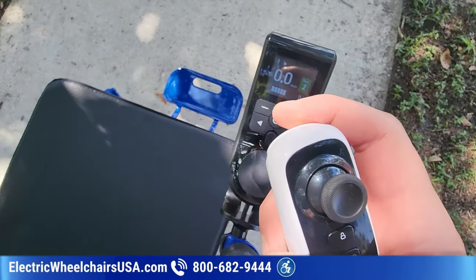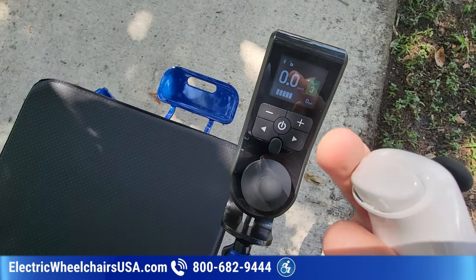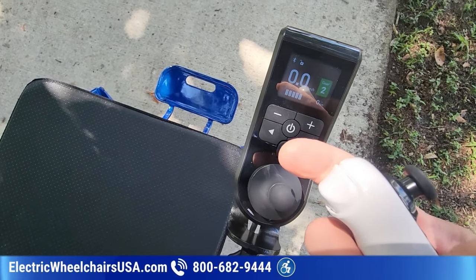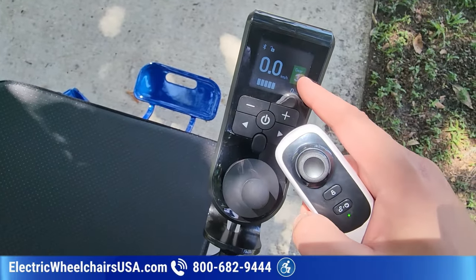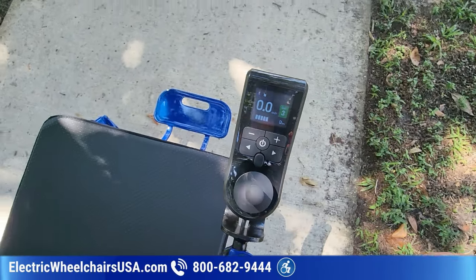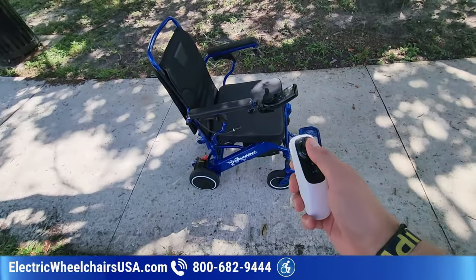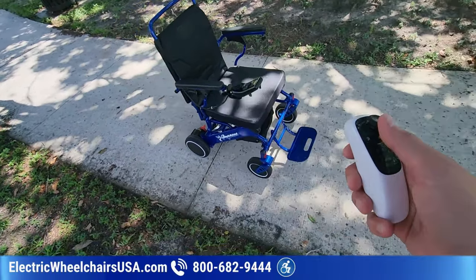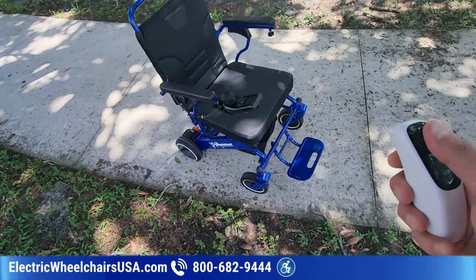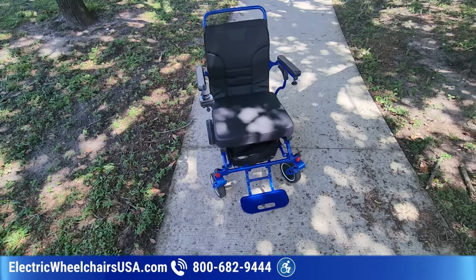I can also increase the speed setting by pressing this button. It'll cycle through, it goes 1 through 3, but if you notice, it only goes to 3. Now, if I adjust the speed on this joystick itself, it goes up to 5. But I like this because you can stand beside the user or the person you're taking care of, and you can operate it, get that face-to-face interaction. You can stand in front of them and talk to them.